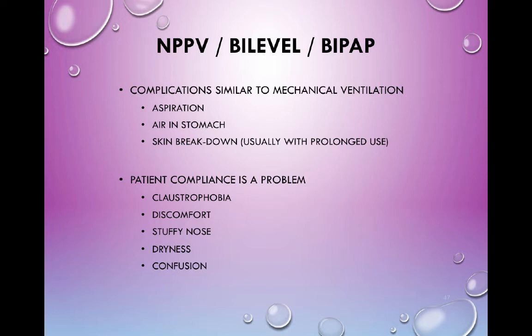And you stick somebody like that on for a day or 2 days, their nutrition tends to be poor, so their skin integrity is not great. We're putting this mask on and strapping it on. Just watch somebody on BiPAP. With every breath, the mask rides up and down, up and down, and that causes chafing. And then these people are really sitting ducks for sepsis if they get a sore. So it's a real challenge in acute care.